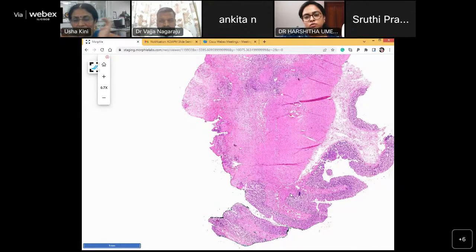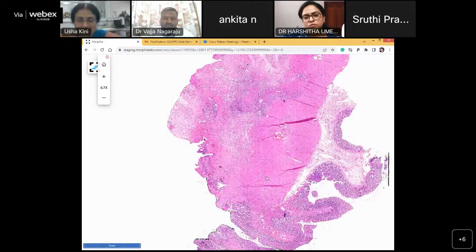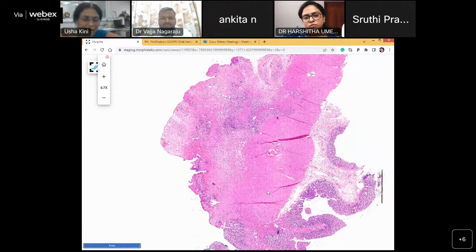He's from North Karnataka. So they did a surgery at 7 years. We do not know what happened. And this is the so-called stoma. That is why you find colon against the skin. But it still doesn't change your description much, except that instead of anal, this is going to be skin.